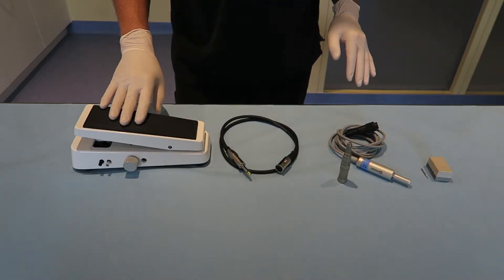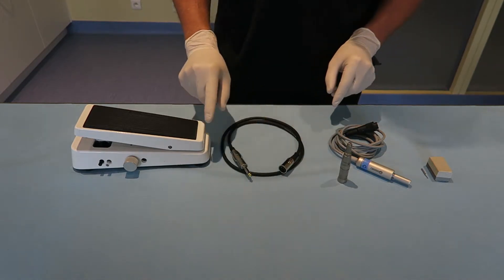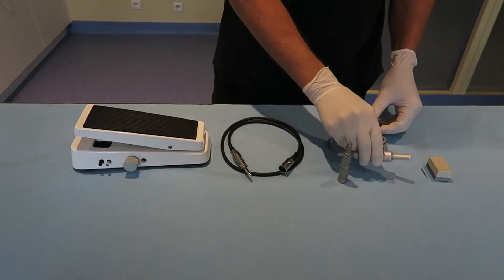The WOW FUE system consists of a foot pedal, a cord that will serve as liaison, a motor and handpiece.